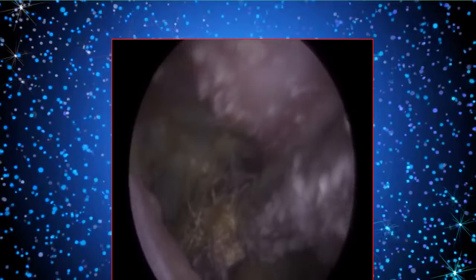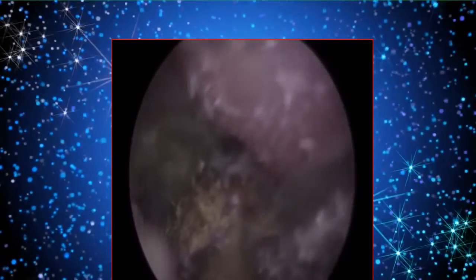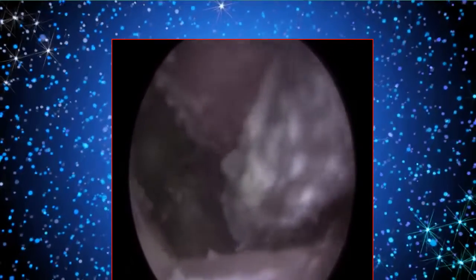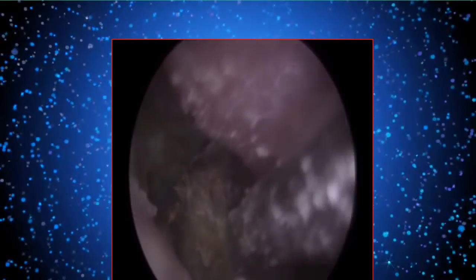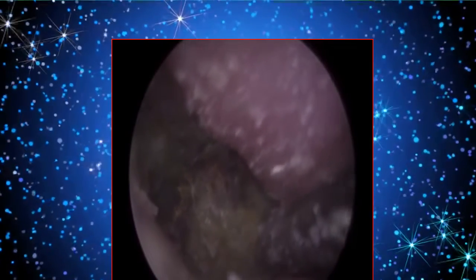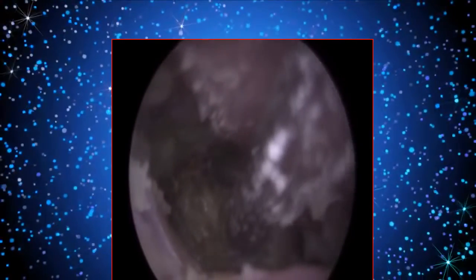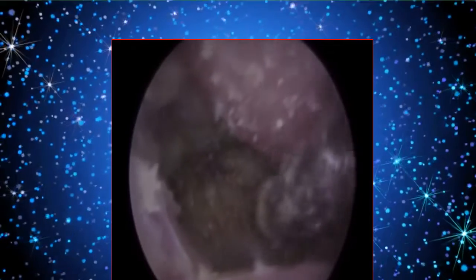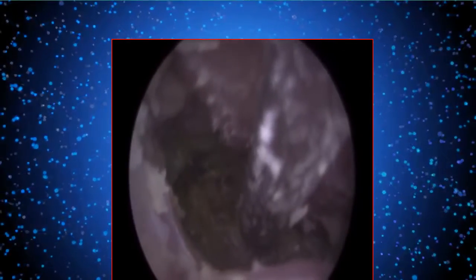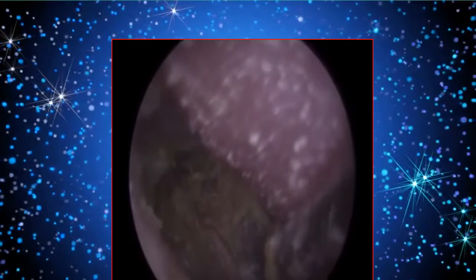It's a very thin layer of skin that's directly coating the bony part, which is very sensitive. Sometimes, not always, when someone's ear is infected and swollen like this, there's a lot of swelling, it kind of provides a buffer effect. So I'm able to use some of these instruments sometimes, not all the time. Sometimes the swelling itself is really tender. But for this particular patient, I found that it wasn't.